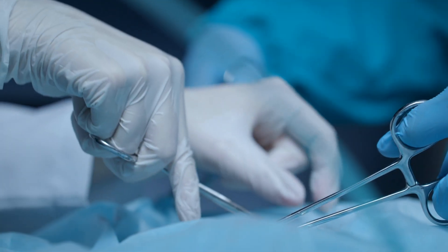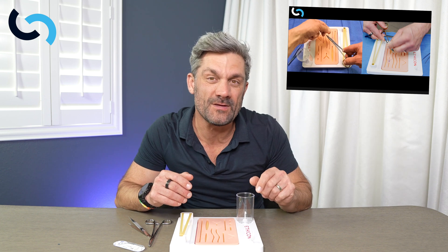Suturing isn't just for surgeons. It is a critical skill that you may need to use in an emergency. I'm a pediatric surgeon and today I'm going to use a split screen, give you a couple of different points of view, so I can show you how to do interrupted sutures correctly and effectively.